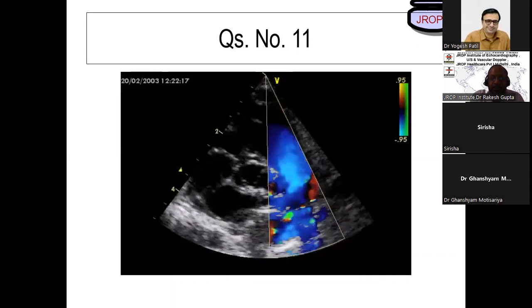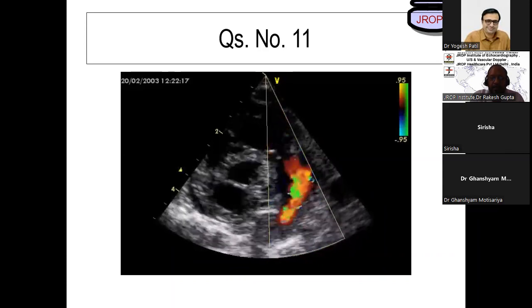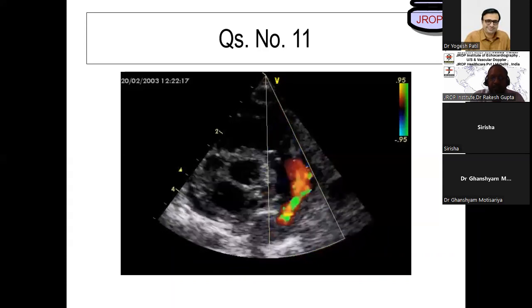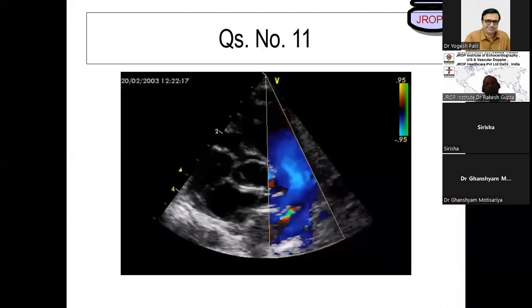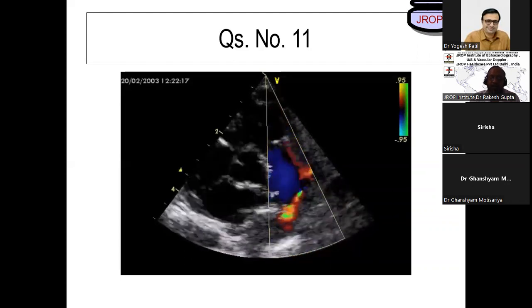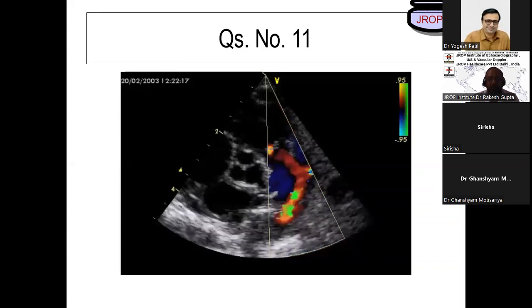This is ductal, which is fetal PDA. You look at the amount of flow which is happening. The principle is any PDA, don't leave it. VSD, hold on till 10 years of age. Majority of those muscular VSD will close by the time the baby grows to 10 years of age. Perimembranous VSD are very difficult to close. They don't get closed. They need surgical closures. Muscular VSD, majority of them close.